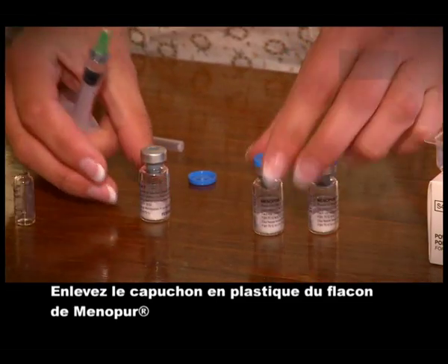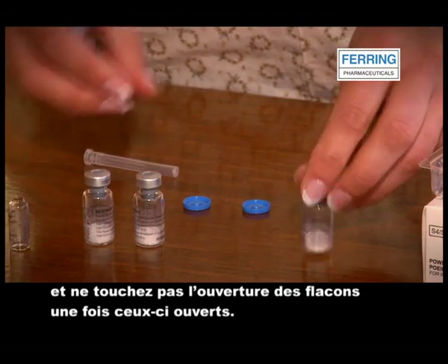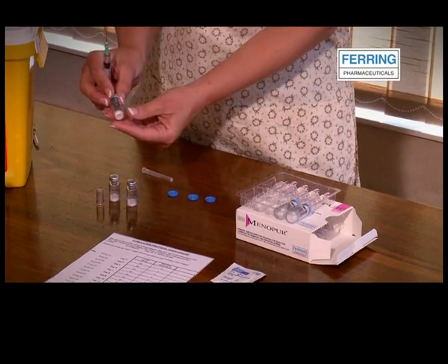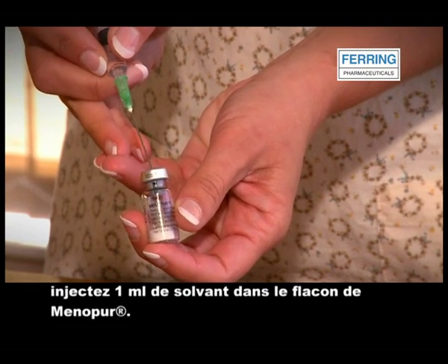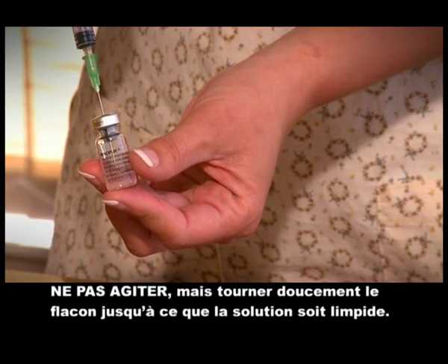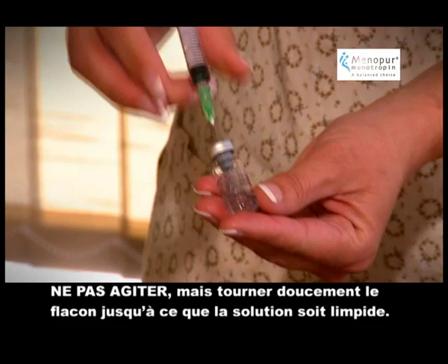Remove the plastic cap from the top of the Menopur and don't touch the tops of the vials once you have opened them. To prepare the Menopur solution, inject 1 milliliter of solvent into the vial of Menopur. Do not shake, but gently swirl until the solution is clear.